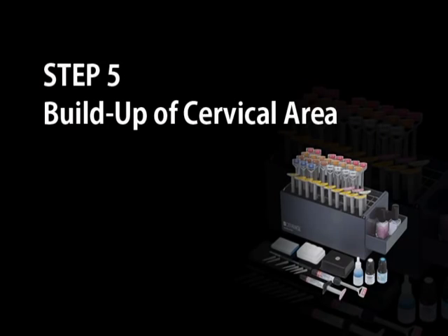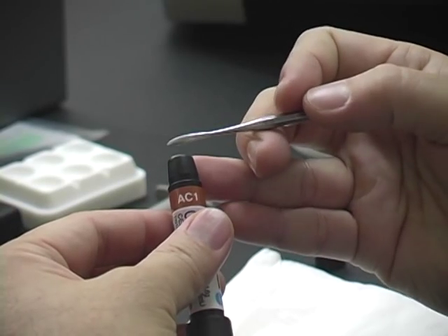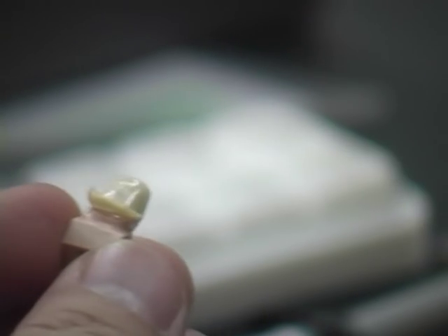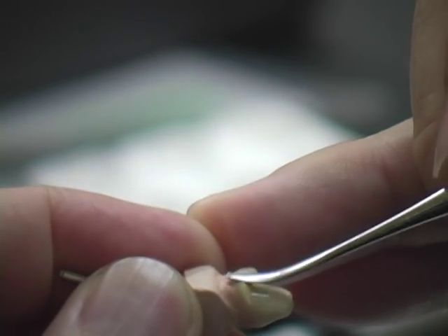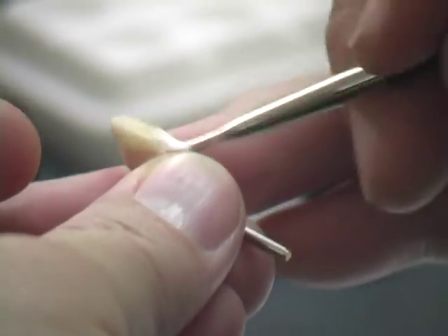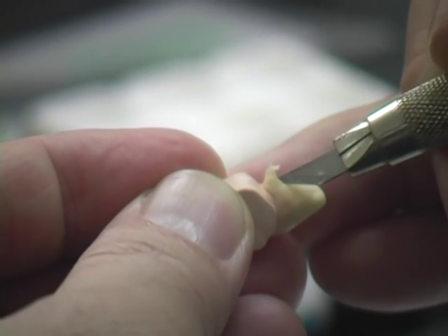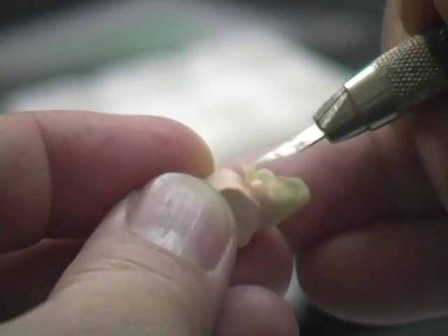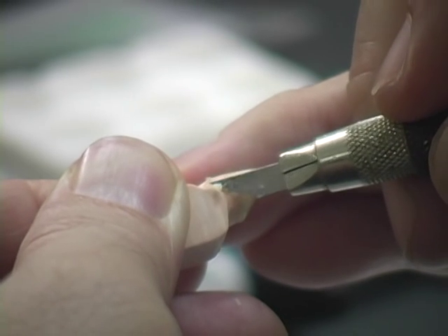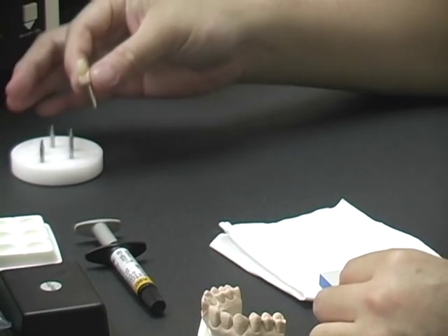Build-up of cervical area. We will build up the cervical area by selecting AC1, designed for A2 shade. Dispense the required amount and apply over the cervical area, pressing gently to avoid air bubbles. Use a brush with modeling liquid to smoothen the surface. Apply on the lingual area in the same manner, then smoothen with a brush. Remove the excess from the margin with a cutting knife. Once the cervical build-up is complete, place the die on the tray and light cure for 1 minute.